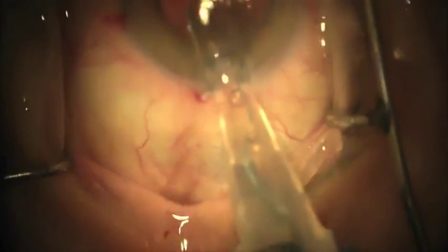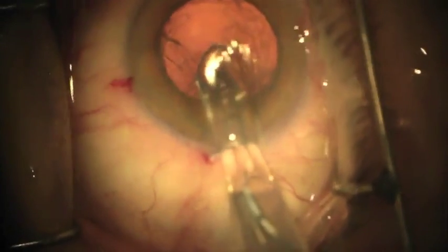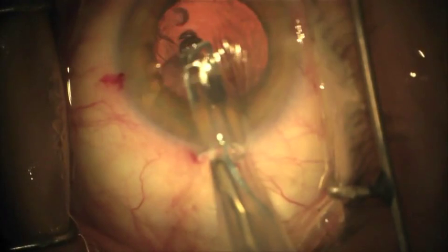Next, rotate the cartridge clockwise such that the bevel is facing left. This allows the leading haptic to exit the cartridge in the proper orientation. You will then guide the leading haptic into the sulcus as you inject the lens.